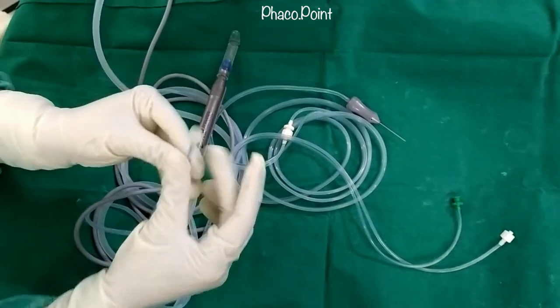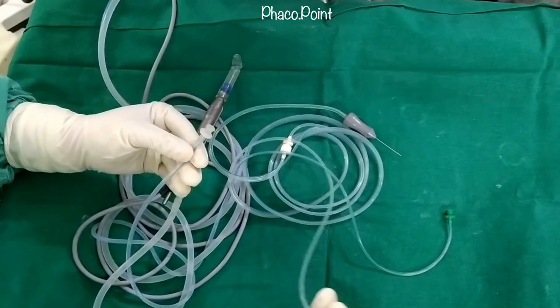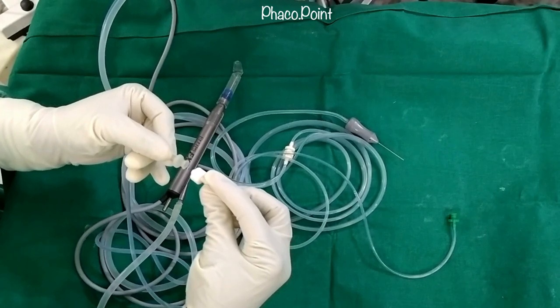The aspiration tubing is disengaged from the back of the phaco probe and it is connected to the aspiration point on the cutter.